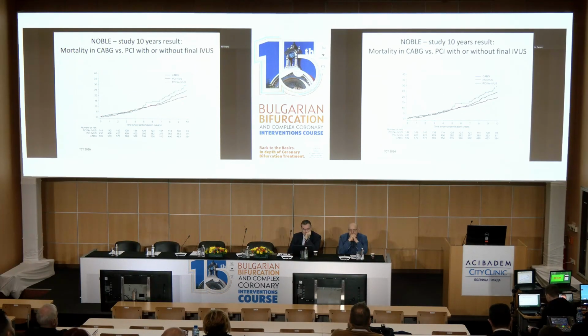However, the latest analysis could show mortality in CABG versus PCI with or without final IVUS. And you see now we have data from a randomized study after 10 years.